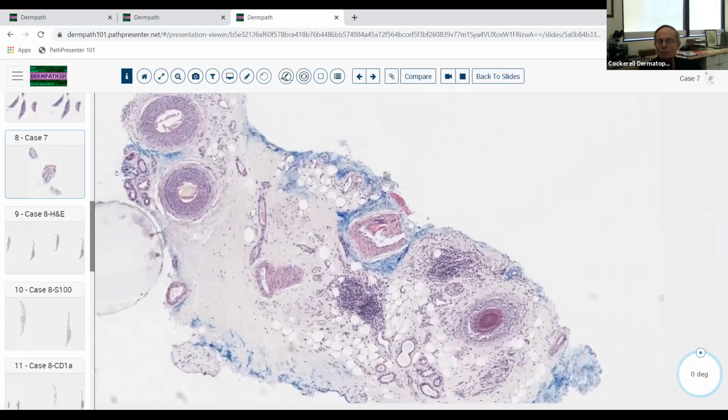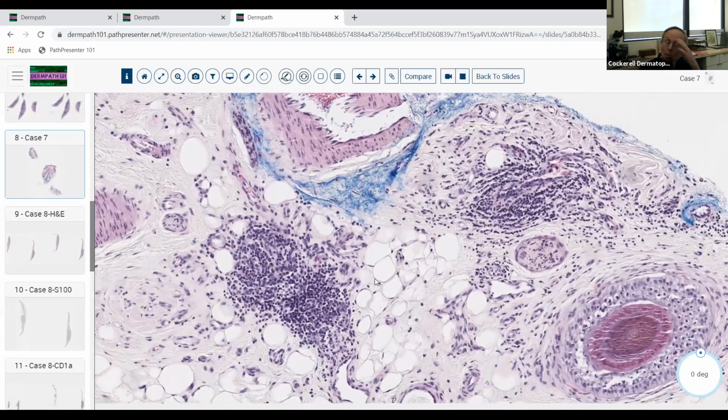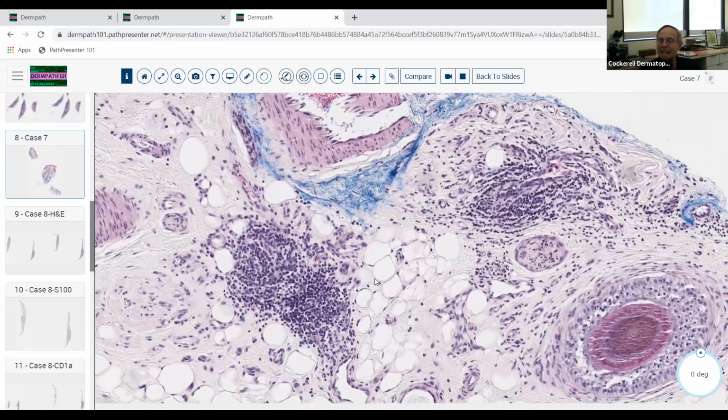And if a patient comes in and they have acute lupus erythematosus, they can get an alopecia areata-like alopecia, which is a relatively acute shedding of hair follicles, and they get this lymphocytic infiltrate commonly, and it looks very much like alopecia areata. But it's not alopecia areata. It's this alopecia that's associated with connective tissue disease in an acute stage, and you can see that with either acute lupus or with dermatomyositis.